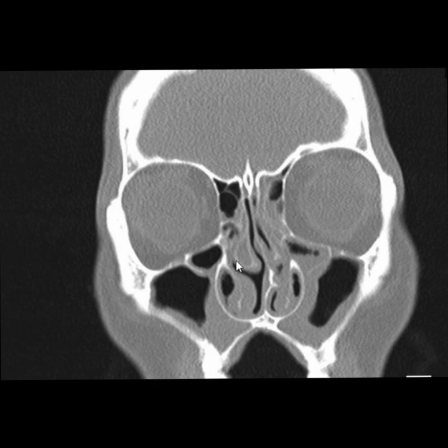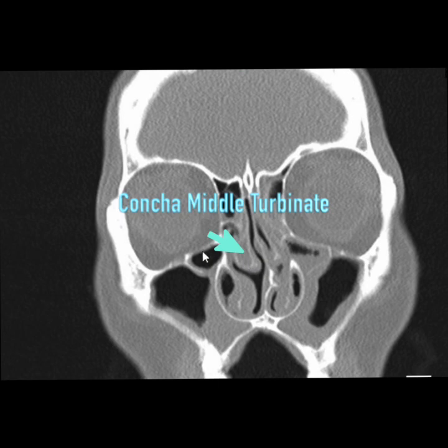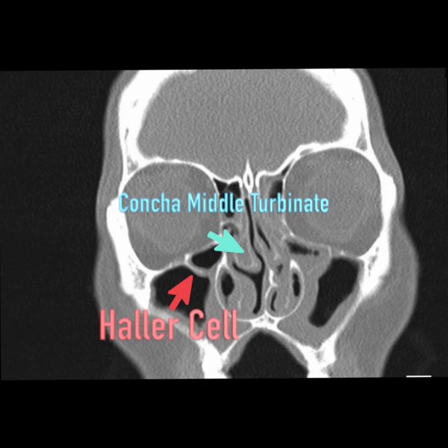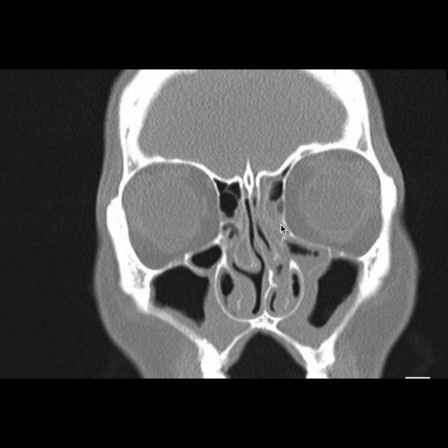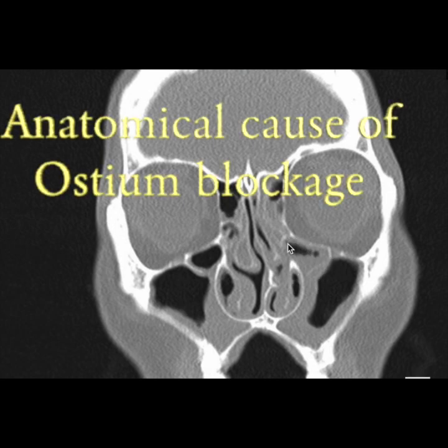Also, the middle turbinate has an air cell — there's a concha bullosa — and a Haller cell. This overcrowding because of the Haller cell and concha can again cause sinusitis. This patient will be symptomatic on both sides and will have on-and-off sinusitis, mainly because of the anatomical blockage. On the left side, the spur, the Haller cell, and the crowding are all causing blockage of the ostiomeatal complex. The frontal cell may also be causing blockage of the frontal recess. On the right side, the prominent Haller cell and concha will also cause ostiomeatal blockage.